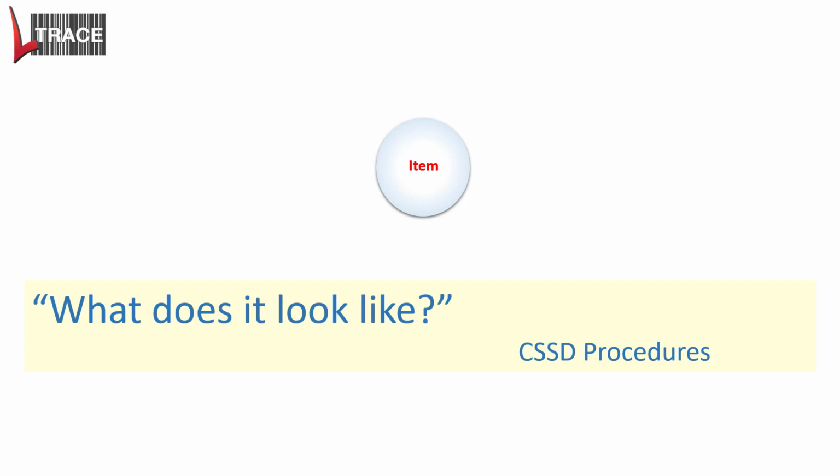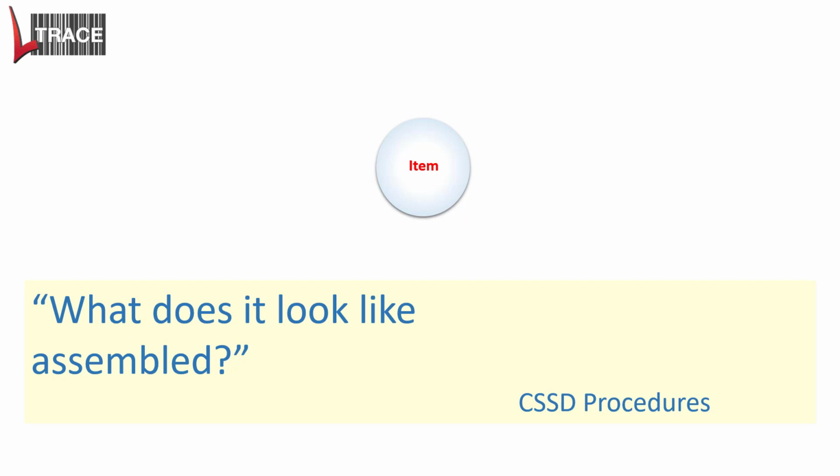You can start to have photos. And so what does it look like? What does it look like disassembled? What does it look like assembled? So those sort of questions are really, really helpful as you're doing the pack and making sure that you have prepared the item correctly.